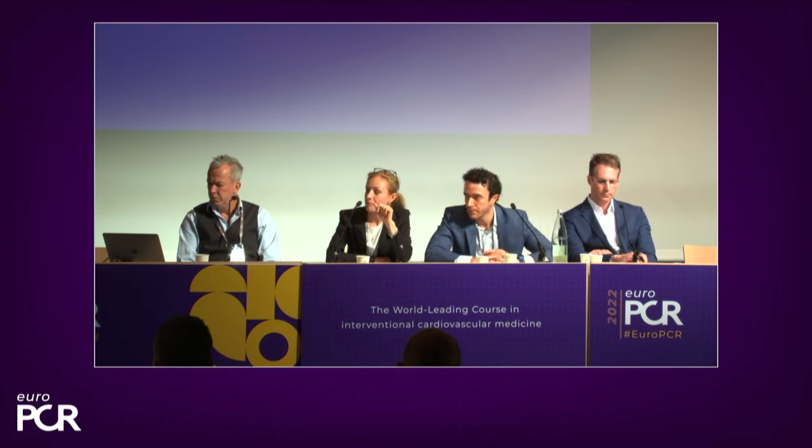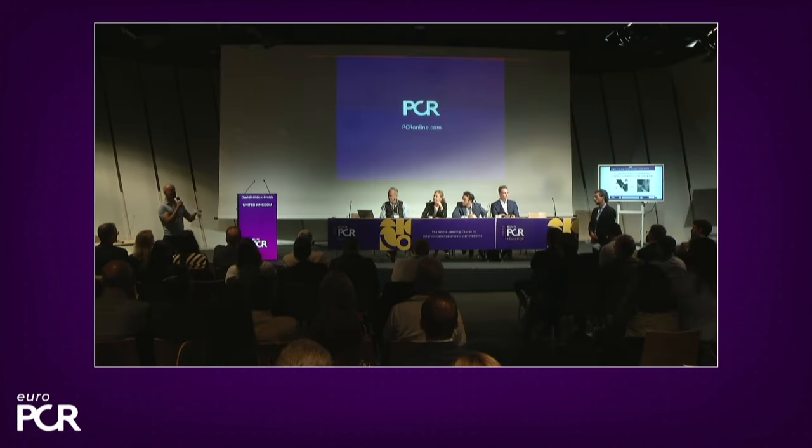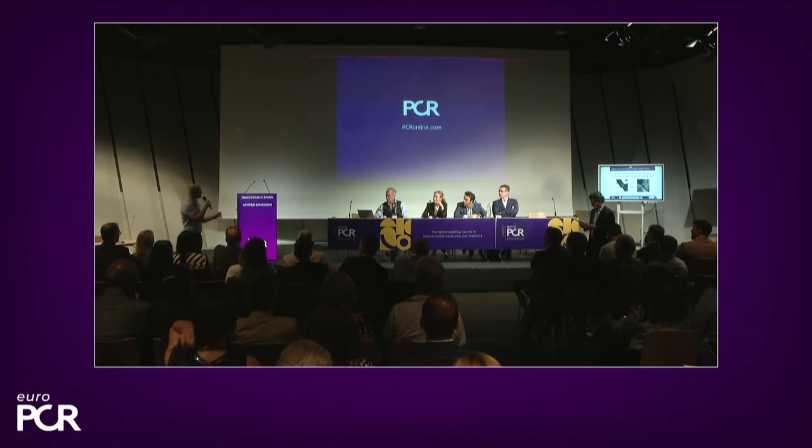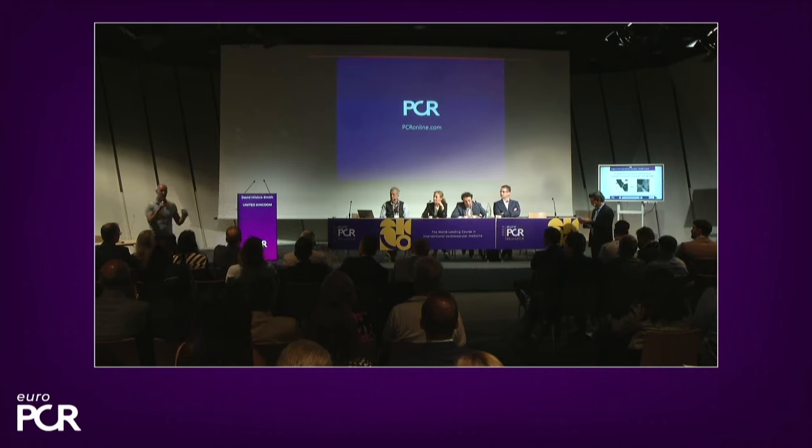Well, and you can go even a step further. We are all considering now these upstream TAVI indications. Assume a patient with moderate aortic stenosis. The valve area will be between 1 and 1.5 centimeters square. If you would replace that valve with a valve that would result in a valve area of 1.4, you're not doing this patient a service. So the expected valve areas that you will get after a TAVI or a surgical valve replacement are becoming very essential also in the context of upstream TAVI.